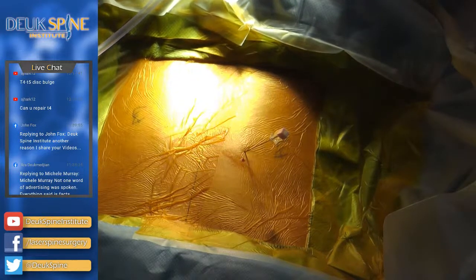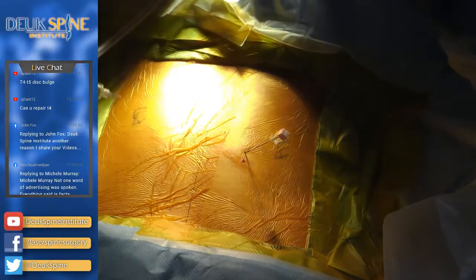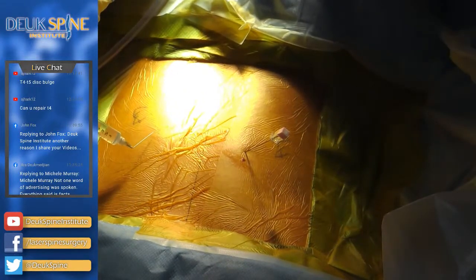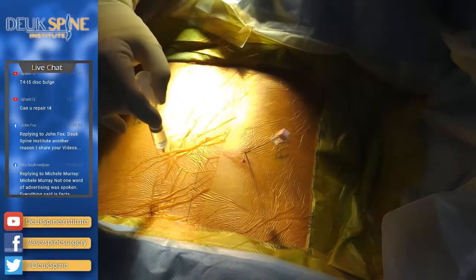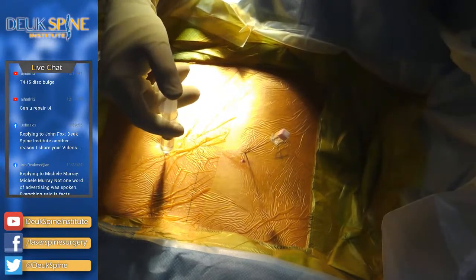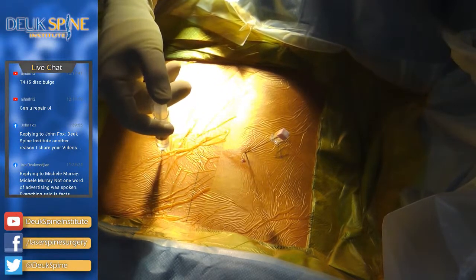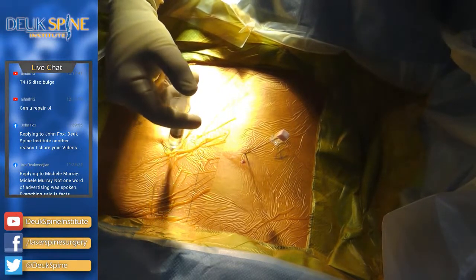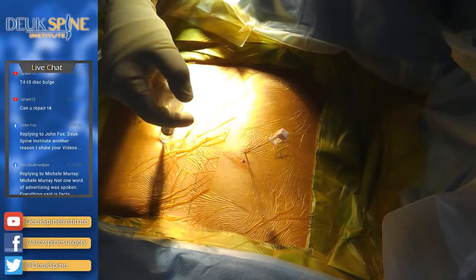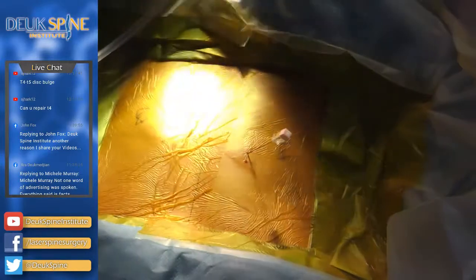All right, I need a little more numbing medicine. So we're done with one side. We're gonna put the access in the other side. And I wanna make sure that it's all numbed up really good. Are you feeling anything in your back? Right now, no? You might feel a little burn. I'm putting some more numbing medicine, okay? Everything's going really good for you. We're done accessing the one side and we're just getting ready to do the other, okay?